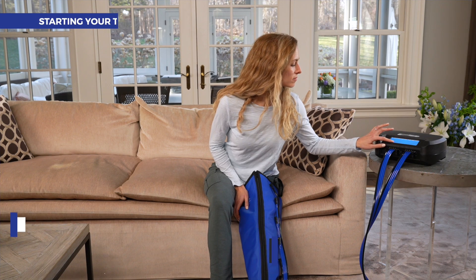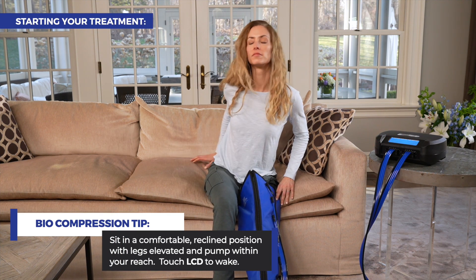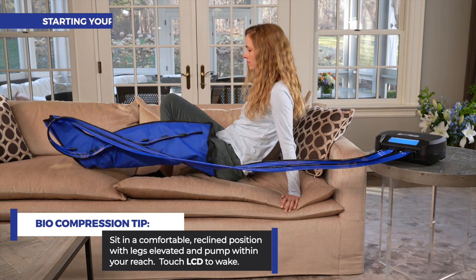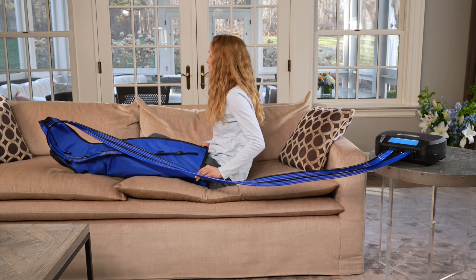Starting your treatment: sit in a comfortable reclined position with legs elevated and within reach of your pump. Touch the LCD screen to wake. After five seconds, your settings will appear on the screen. Press start to begin treatment.